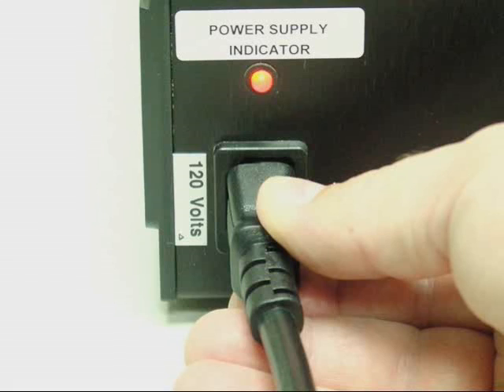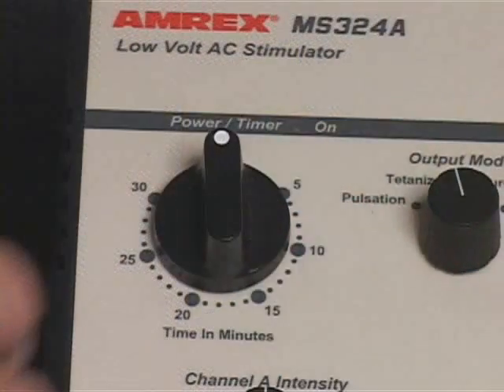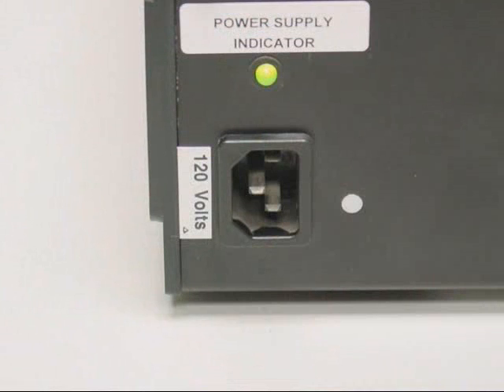The MS-324-AB power supply indicator light will illuminate red when the power cord is connected to the MS-324-AB's AC receptacle and plugged into an AC wall receptacle and the power is off, indicating the battery charge circuit is enabled. The power supply indicator light will illuminate green when the power timer is on and the unit is operating on battery power with the AC power cord disconnected.